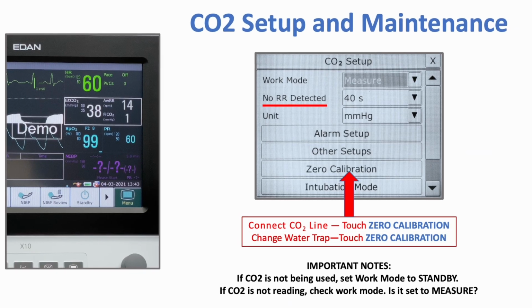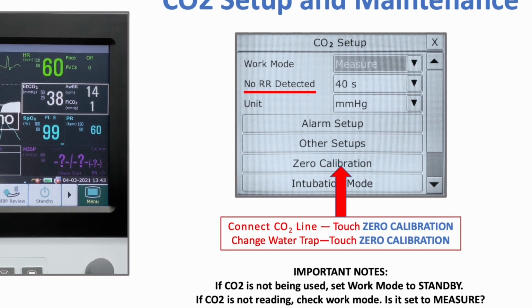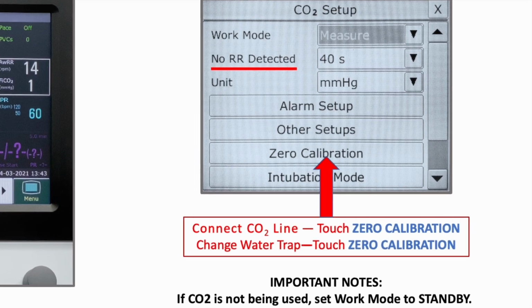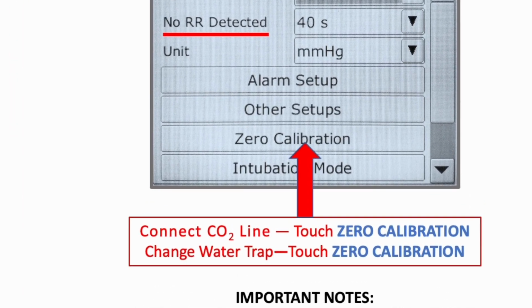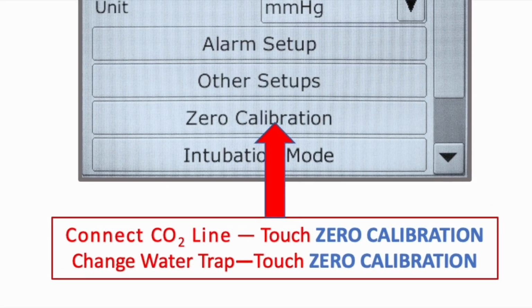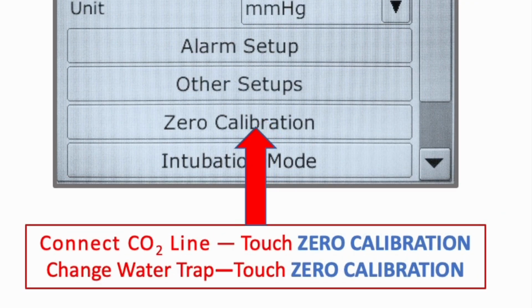It's important to note when changing the water trap or the CO2 sampling line, implement zero calibration by touching zero calibration from the CO2 setup menu. This should be done before the line is placed on the patient. The system briefly displays zeroing in progress. These few seconds of calibration are important to prolong the life of the internal CO2 components.